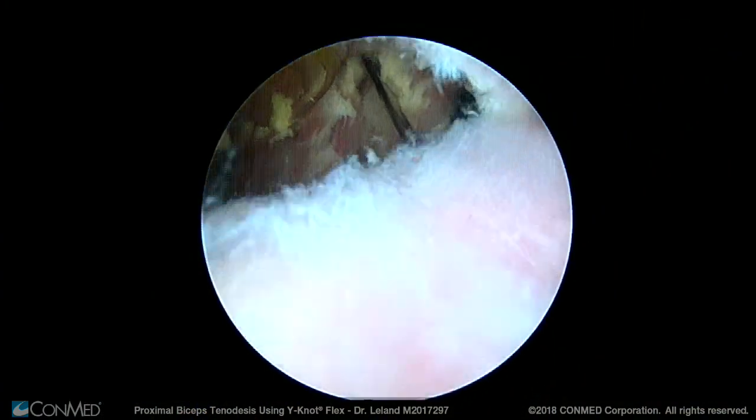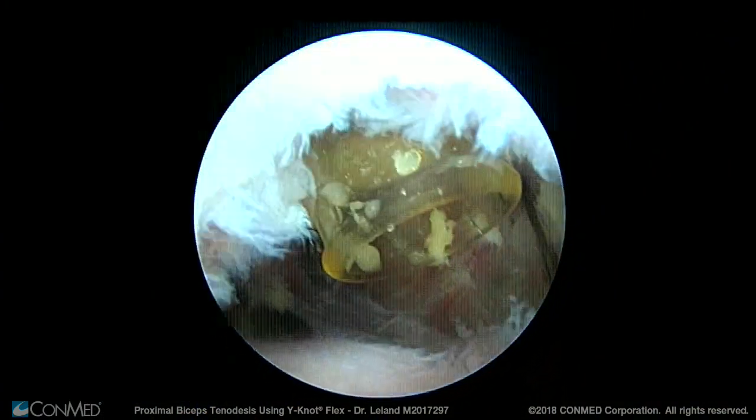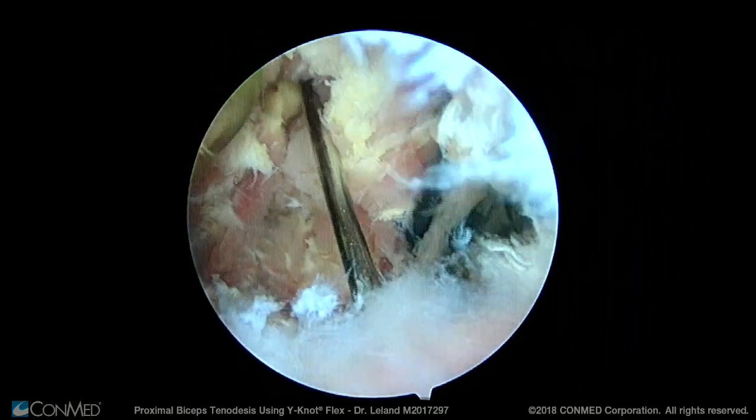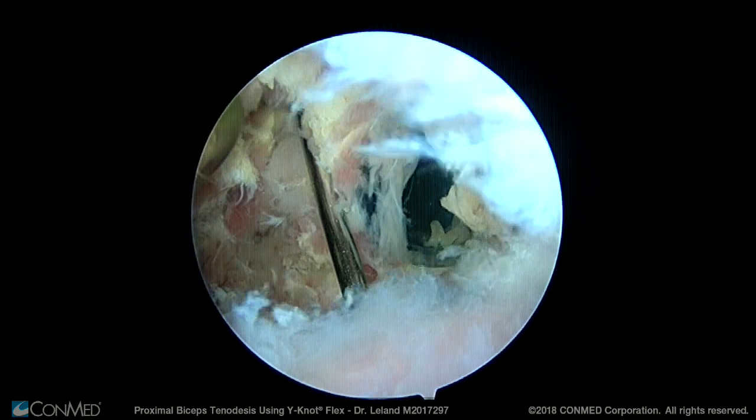Here I'm viewing from the posterior portal, looking at the rotator cuff, my lateral portal, my anterior lateral portal where you can see the spinal needle, and my anterior portal.